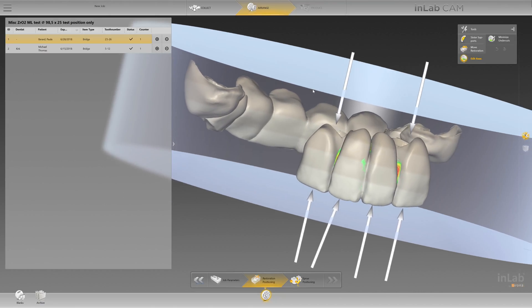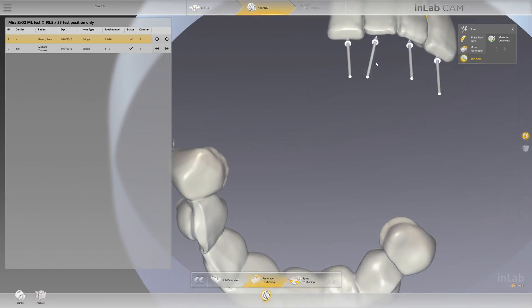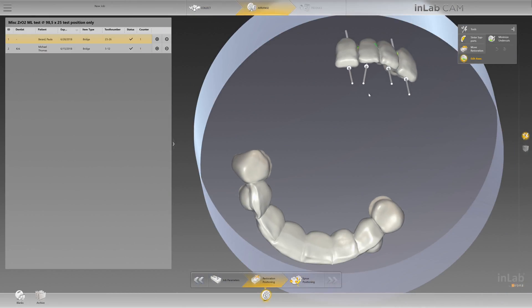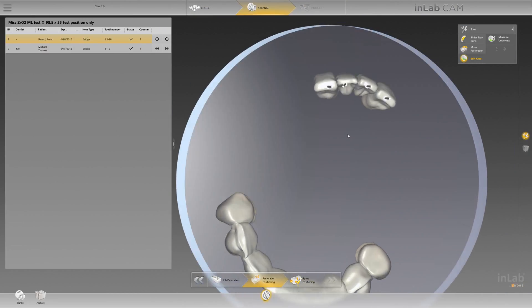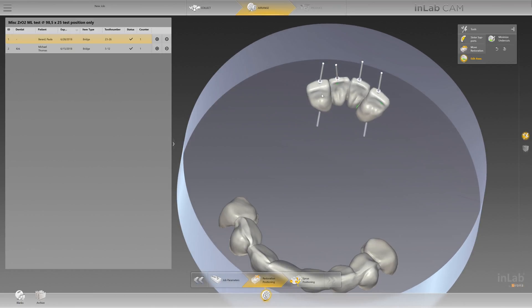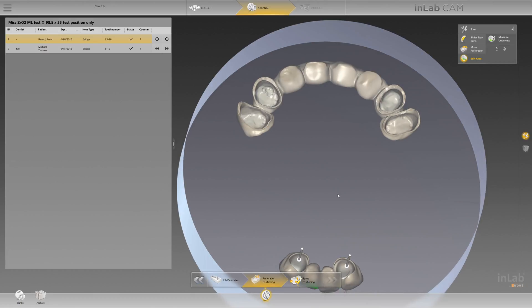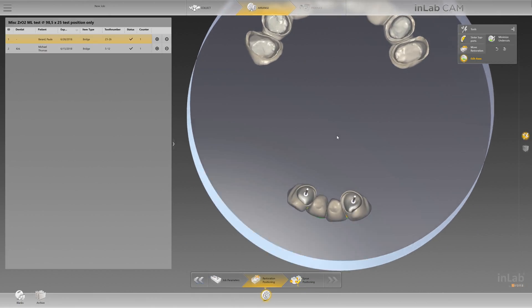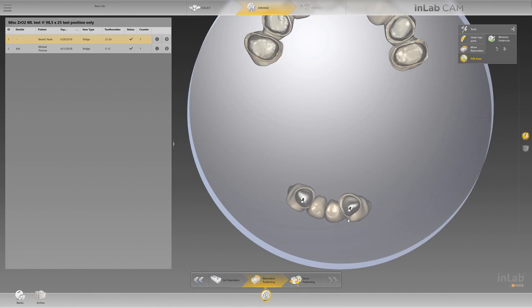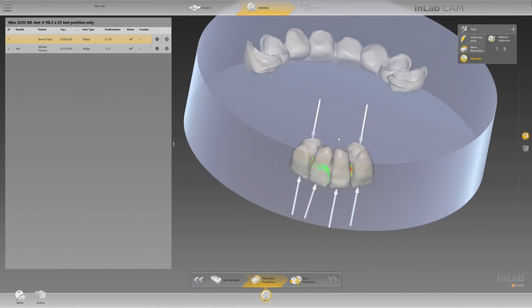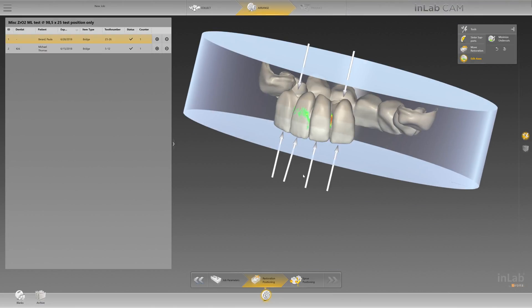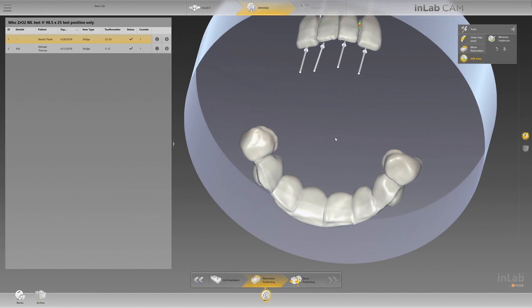Or you can adjust your axis as well by just controlling these arrows. Now I don't do much of it on the internal aspect of my restorations. Every once in a while I will, but for the most part I'll adjust it on the incisal part of my restorations.